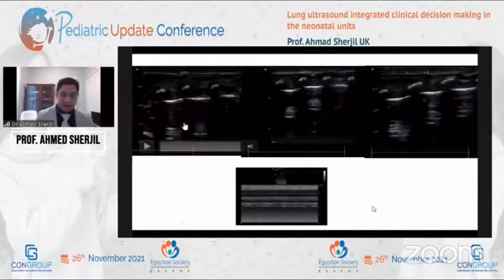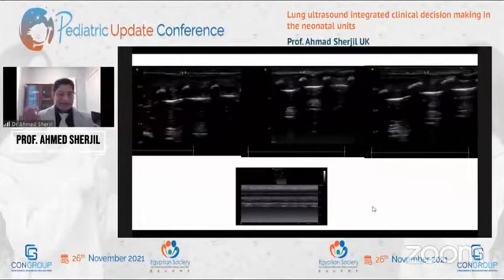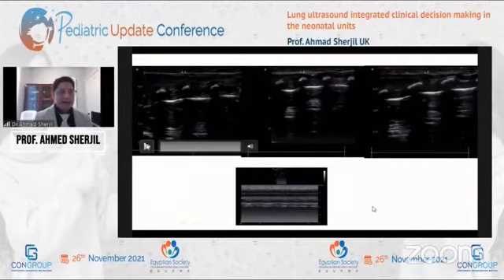Moved on to the left, which took less than a minute. And here, even before I move the slide, you can see this is different. It strikes at you. Even if the nurses standing by the side didn't know how to scan, they could say that this is completely different from what they had seen on the right side. So I'm going to run this here.